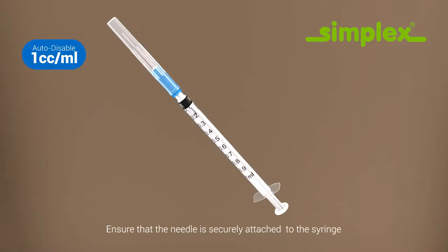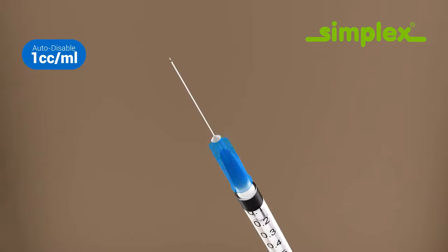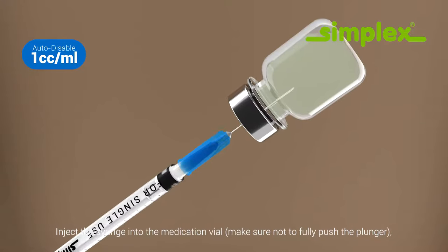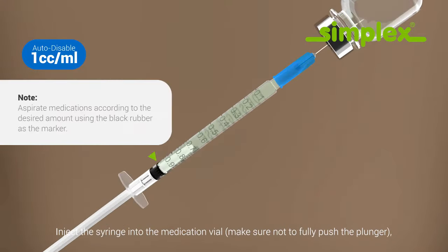Ensure that the needle is securely attached to the syringe. Inject the syringe into the medication vial. Make sure not to fully push the plunger, then withdraw medication.